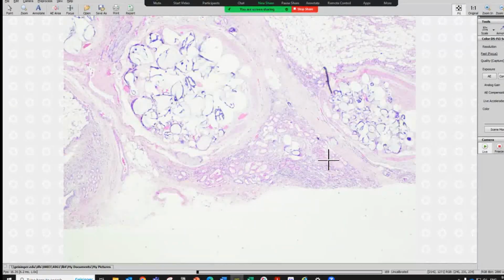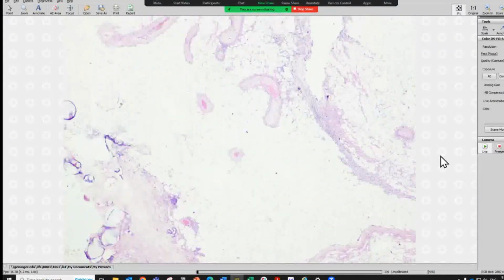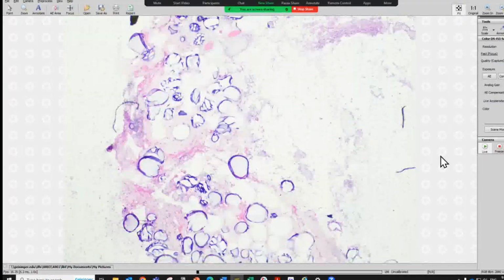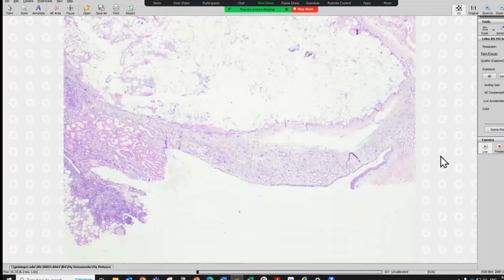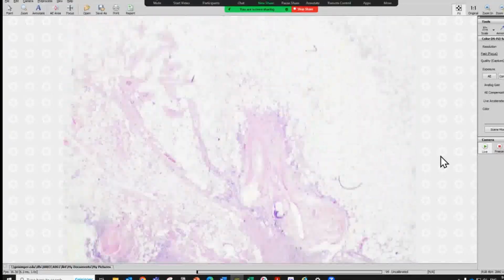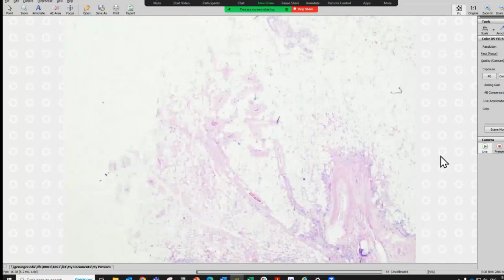Here's some normal kidney, tons of fat, vessels, and some unknown things. Some people may know, some people may see this kind of thing for the first time. But if you are interested in derm path, you will see this quite often compared to other subspecialties.